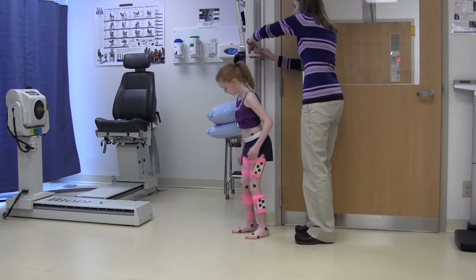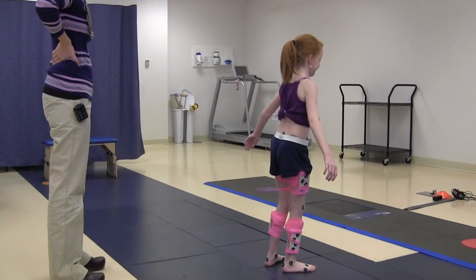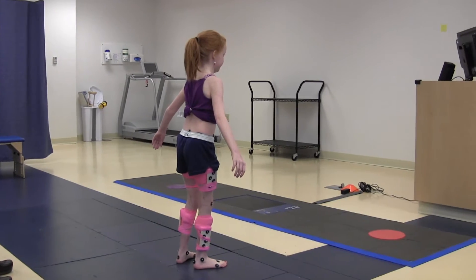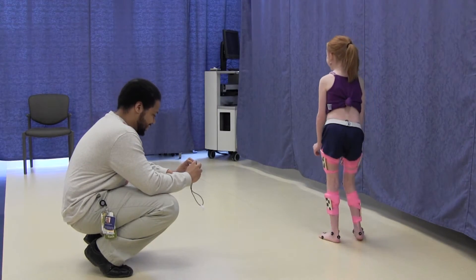I will walk without my socks or shoes on and the floor might be cold. Next, I will stand in the middle of the room on the blue line and have to stand still for 10 seconds. The lab assistant will take pictures of my feet and legs while I stand still.